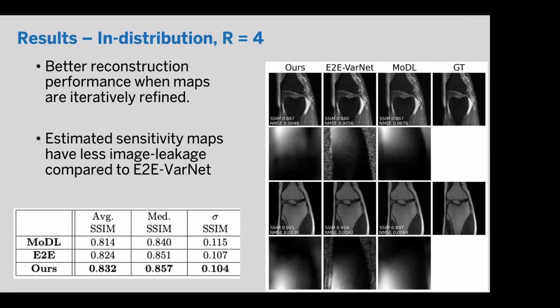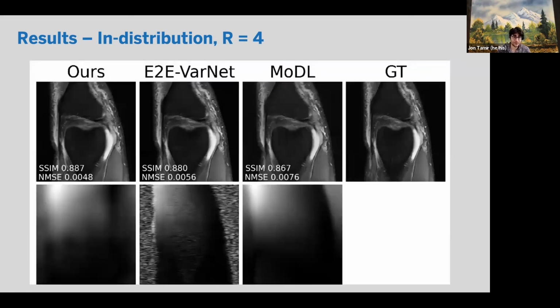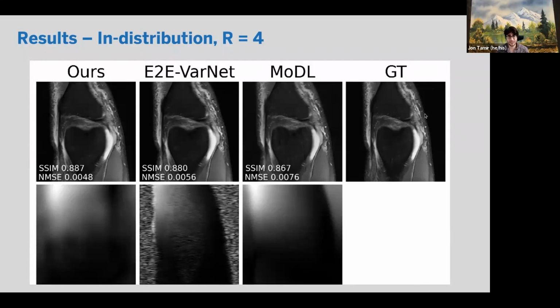Yeah, thank you. And so when you train the models, how do you deal with background noise? How do we deal with background noise? Yeah. I'm not exactly sure I understand the question, but there are two sets of background noise. This is just a scan, this image, the ground truth. So it itself might have background noise, and it's a question of, do we really want to call that the ground truth? So that's maybe the background noise you mean, but then maybe you mean the background noise of our reconstruction. I mean the ground truth. Yeah, that's a good question. So we're not explicitly dealing with that, but we hope that by seeing enough training samples, that kind of effect gets averaged away.